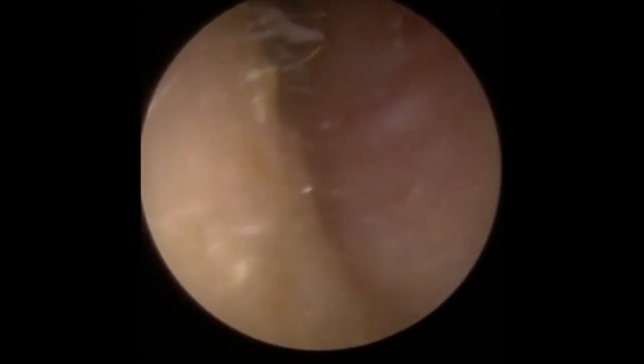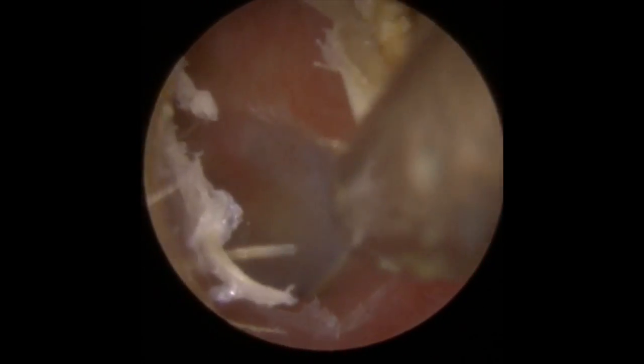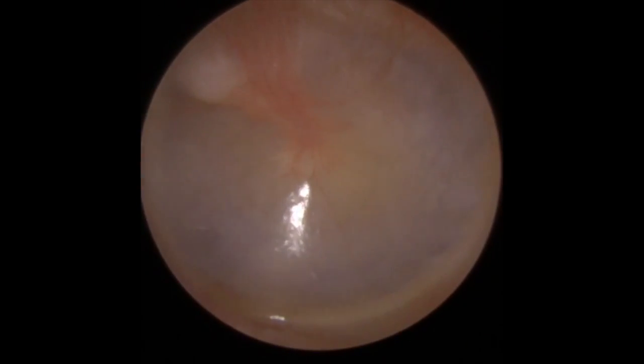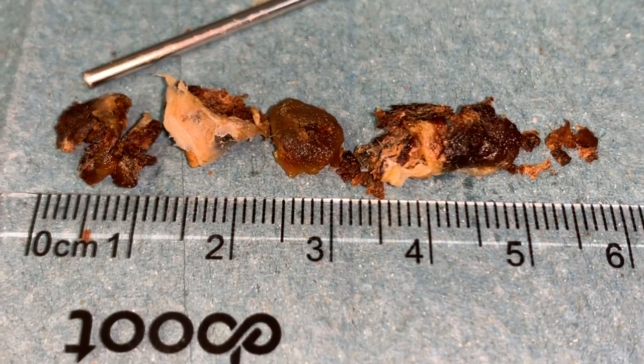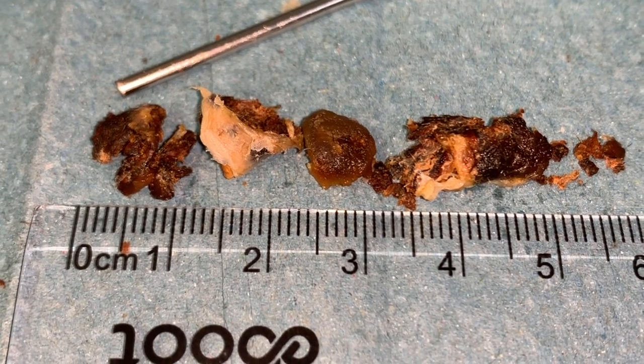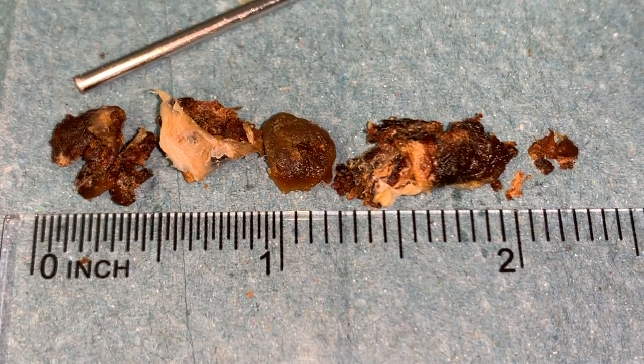Much easier to do that than to try and dig around it with the Jobson horn. There's a little tiny bit of dry wax to the left-hand side, so I'll just take that away with the suction. You can see the redness and irritation around the outside of the ear canal there where that dry piece has come away. So this is what we removed — the section between 3.5 and 5 centimetres, that was what came out of the first ear; the rest came out of the second ear. Some nice big meaty bits of wax in there.